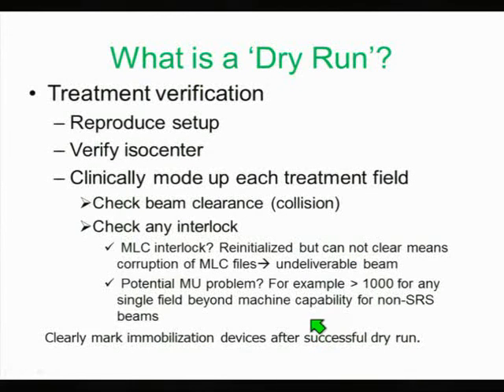During the dry run, you can also discover the patient's condition. A lot of times the patient will say, I cannot handle this, it's too long, or something. But treatment is going to be just as long. So the doctor can decide, okay, before the next treatment, I will give the patient some medication to help them relax. These are the processes through which you can discover beforehand any potential issues, whether related to the patient or to your technique. So it's very important.